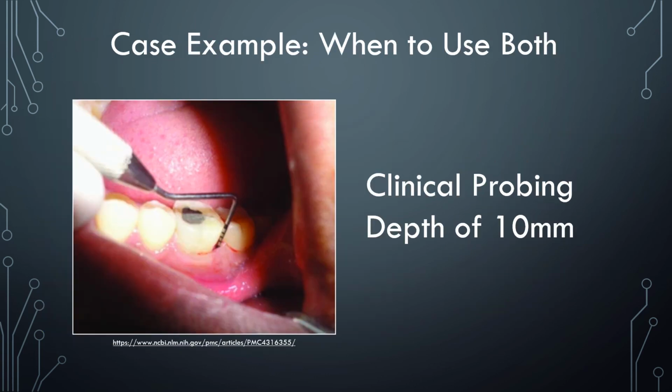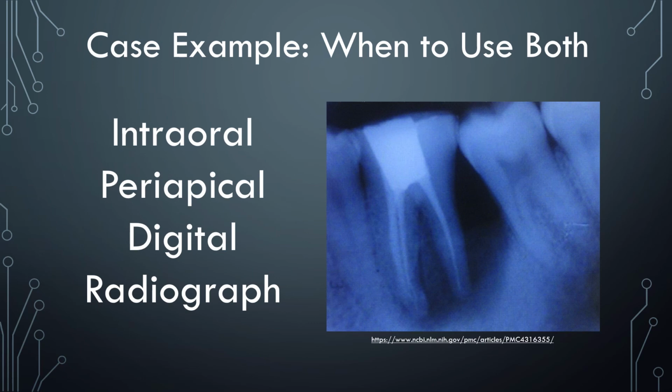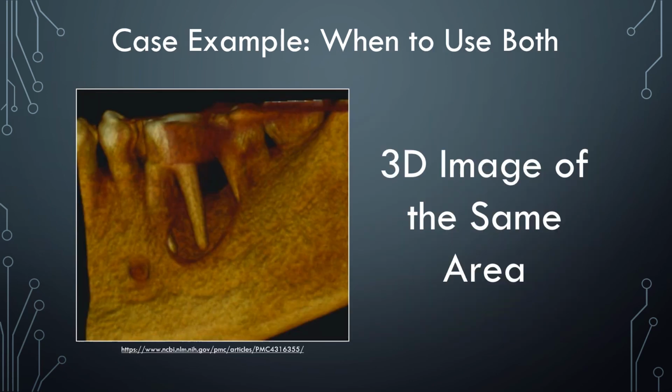As you can see here, this is a client with a probing depth of 10 millimeters. Digital radiographs were used to detect bone loss. Further 3D imaging was used in the same area to gather more information for an accurate diagnosis.